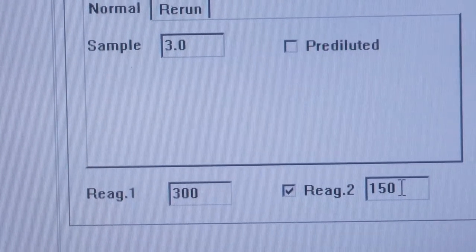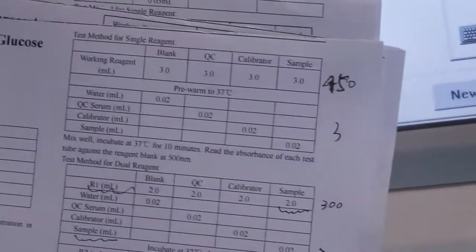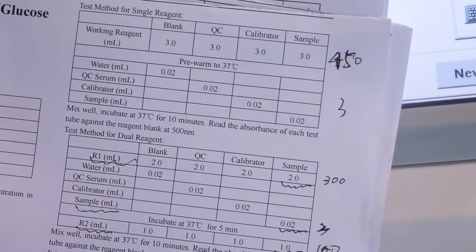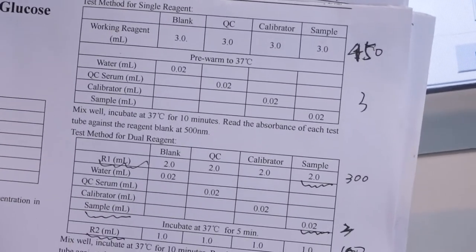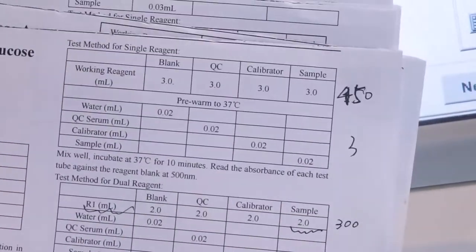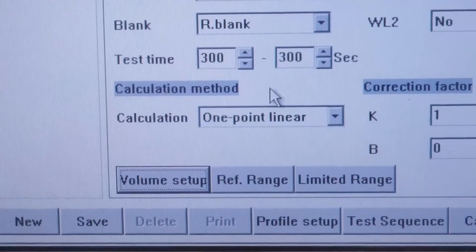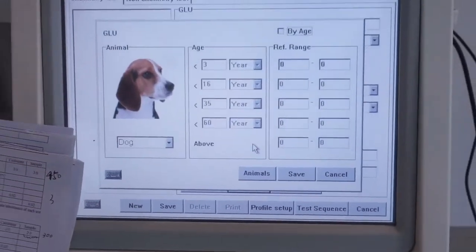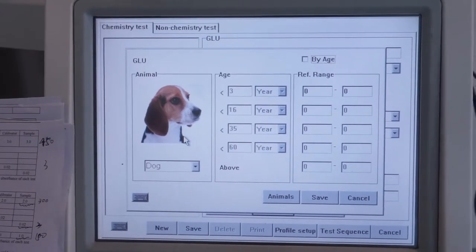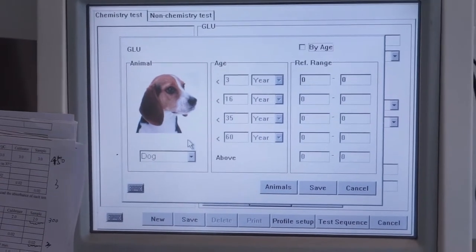Because this machine is an open system, you can also use another brand of reagent. Some reagents may have only one reagent. If the reagent instruction just has one reagent, you don't need to choose reagent 2. Just input reagent 1, it's okay. After inputting that, you can click save. And for the reference range, you can see the range, right? This range, different areas have different ranges.